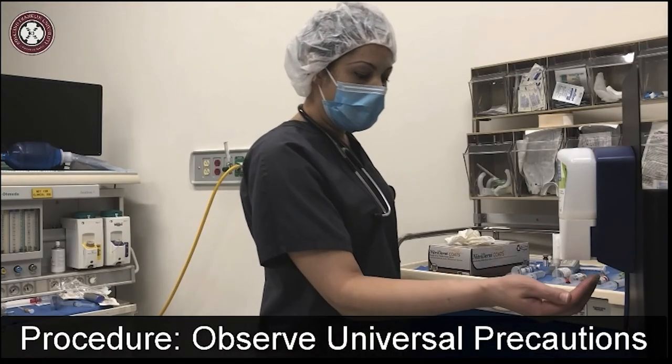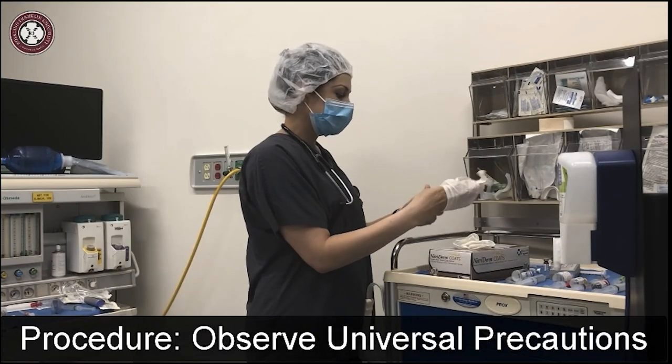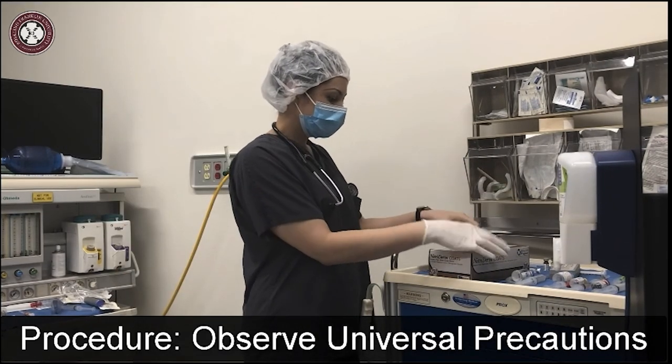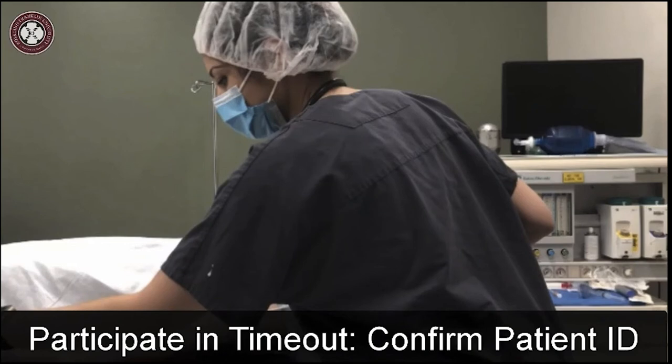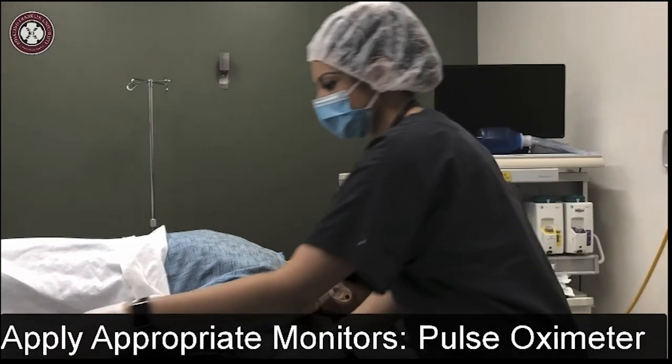Maintain universal precautions. In the OR, the provider should at least be wearing a surgical cap, mask, and gloves once hand hygiene has been performed. When the patient arrives to the OR, a timeout must be completed and the patient's ID confirmed with at least two identifiers. Appropriate monitors should be placed on the patient to obtain baseline vitals.